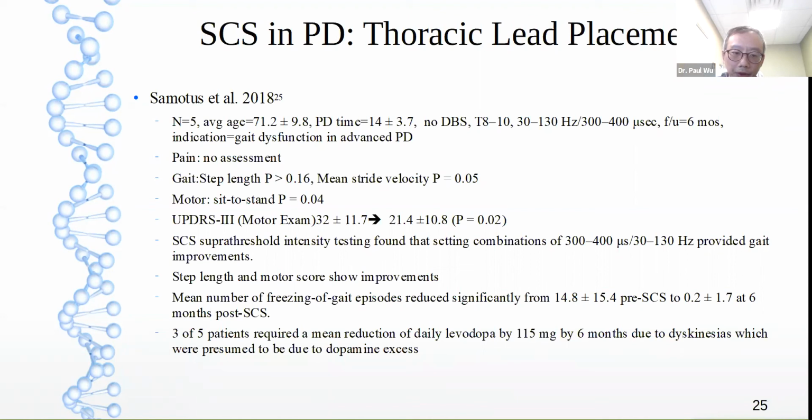and they also show that the freezing of gait episodes were reduced significantly at 6 months post spinal cord stimulation. And there's also a reduction of daily levodopa by 115 milligrams by 6 months in 3 out of 5 patients.